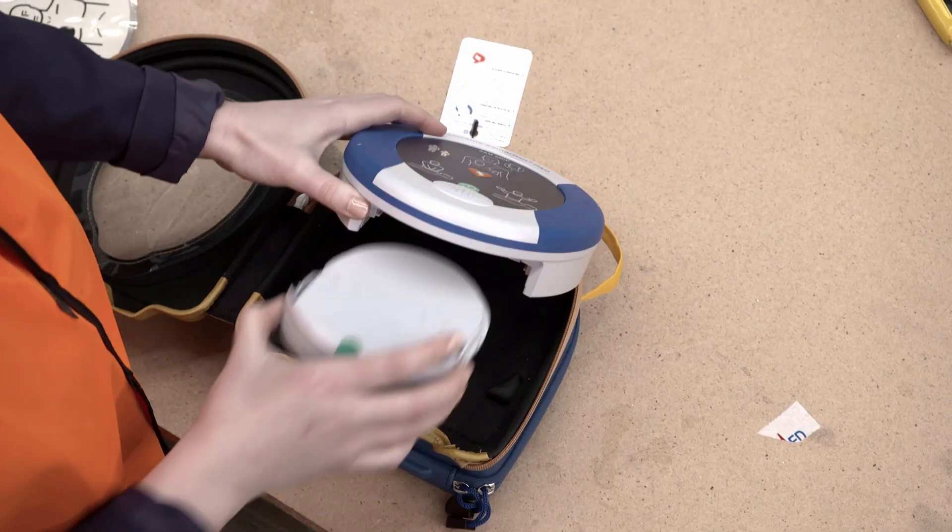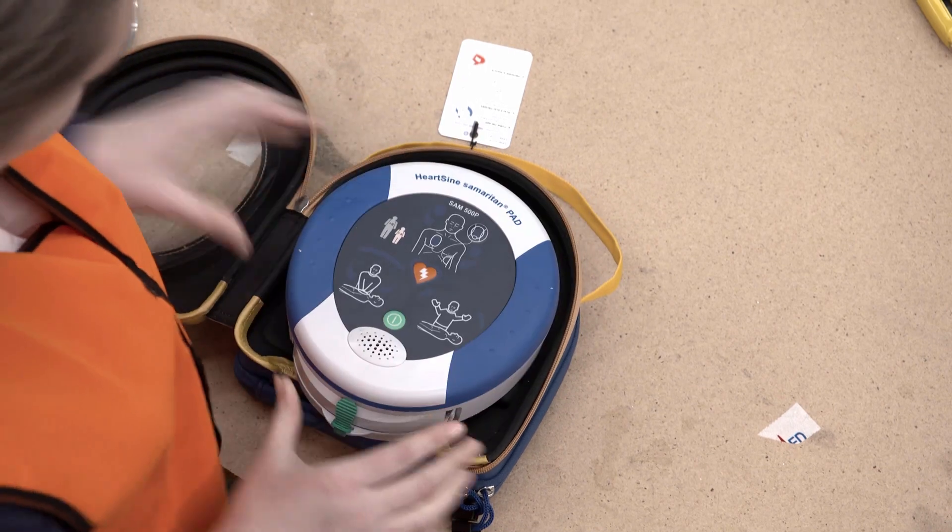Insert the new battery and pad pack into the Hartsign unit until the tabs lock into place.